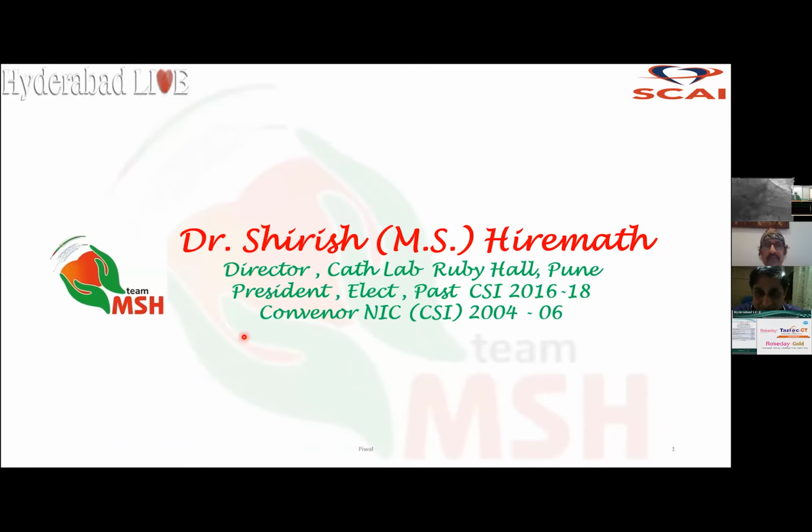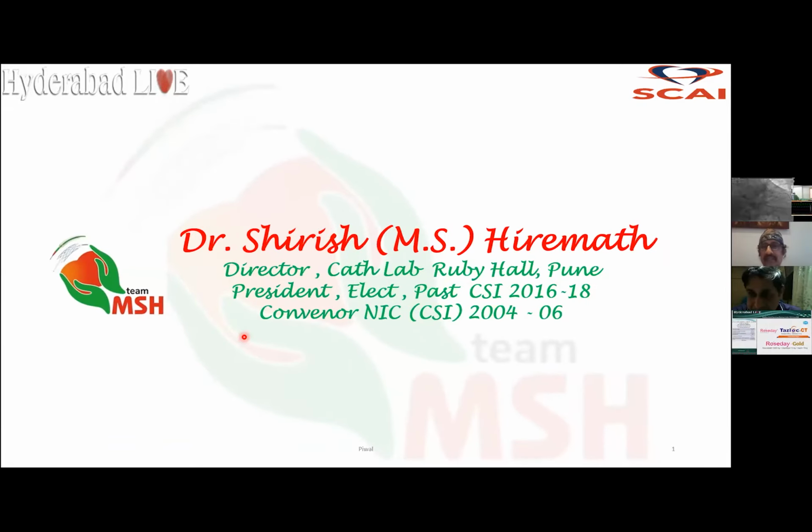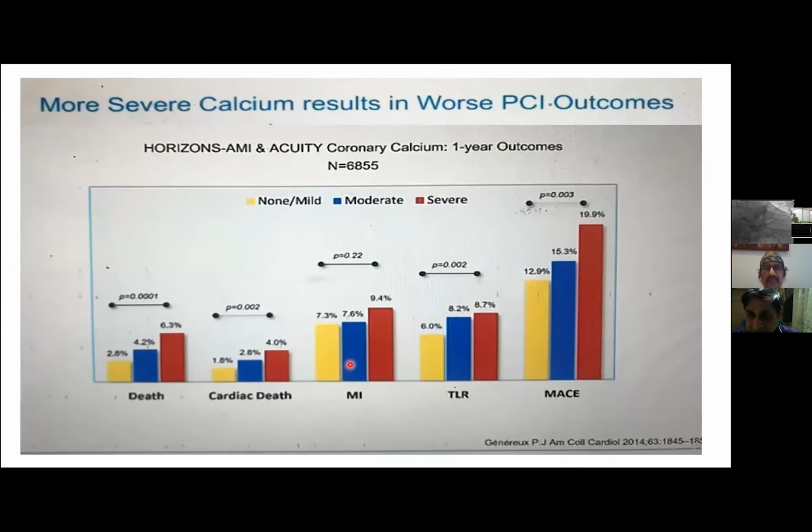Good afternoon, everybody. We are now going to look at OCT in the calcified region. I feel OCT's biggest advantage is in the assessment of calcium, because calcium, as we know, is a big issue in the results, short term as well as long term. If you have a heavily calcified artery, the results are poor, while if you have mild to moderate calcium, the results are far better.